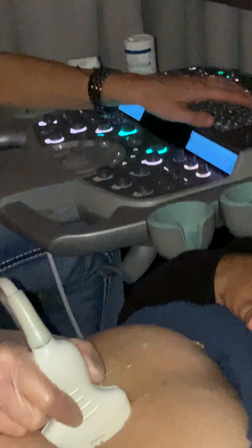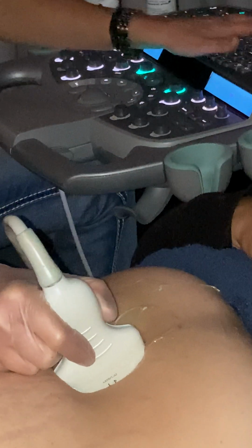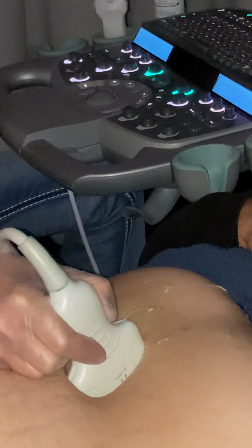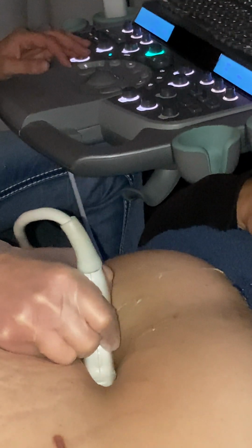Okay, so then we're ready for transverse. A-O, oops, I made this lowercase. Okay, we've done this before. I have no idea, it was my first day. Okay, so going into transverse.